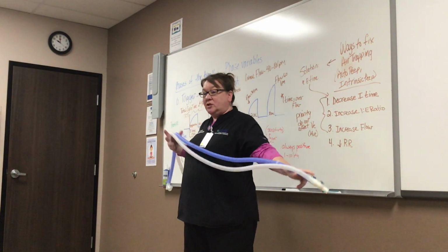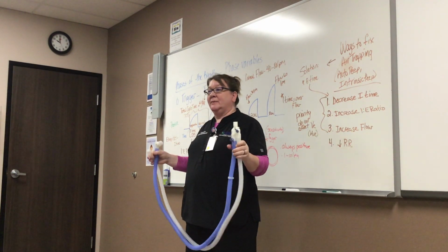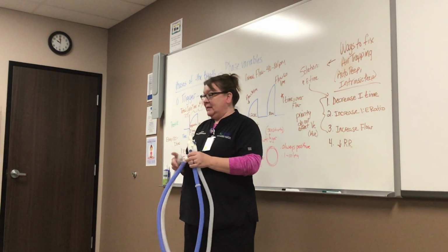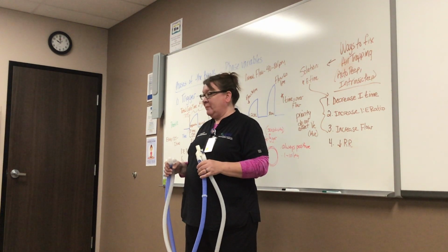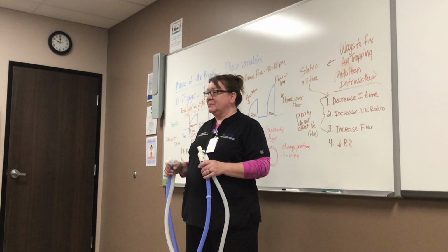Did you guys have a question on the homework that asked what bias flow was? Did anybody find it? I Googled it. What did it tell you? The flow oscillation, when you're in a certain mode. Continuous flow of gas responsible for replenishing O2 and removing CO2 from the patient circuit.